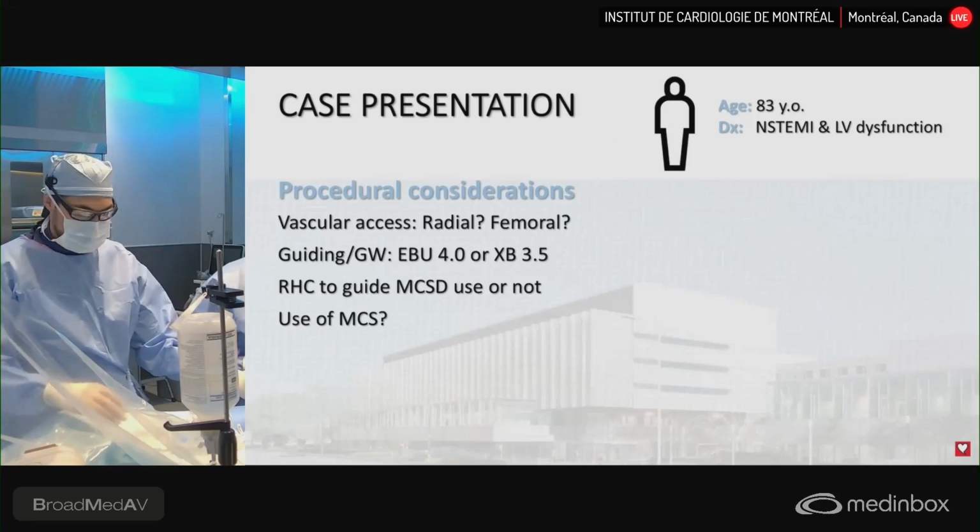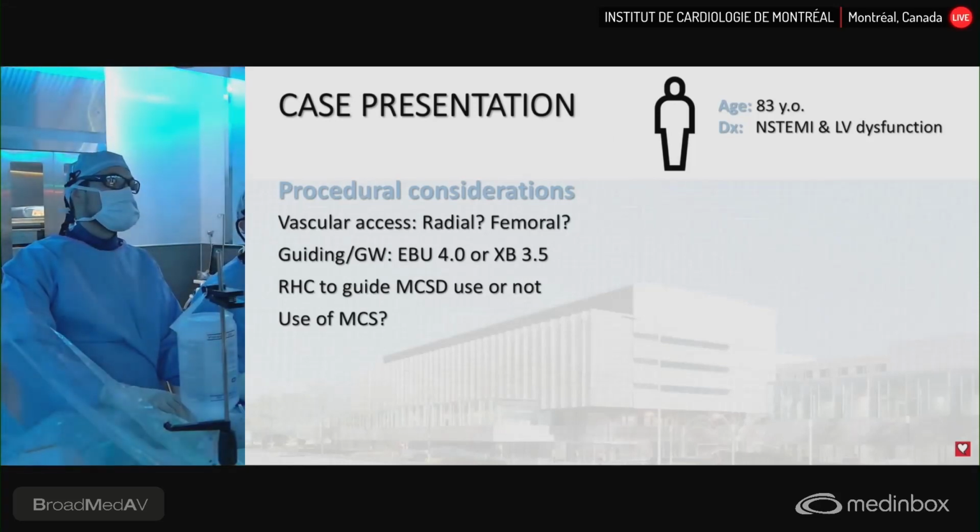So maybe I'll let Dr. Tanguy talk about the considerations of this case. Thank you, Robert, while you do the IVUS at this time.